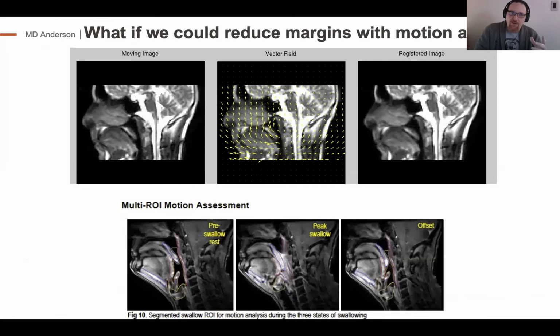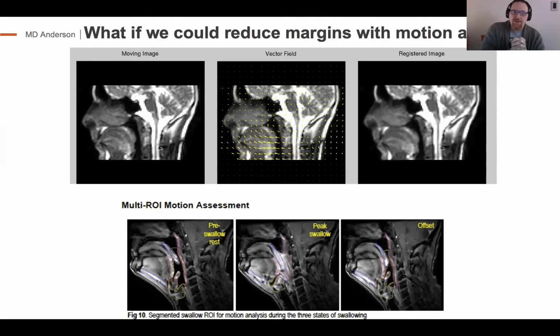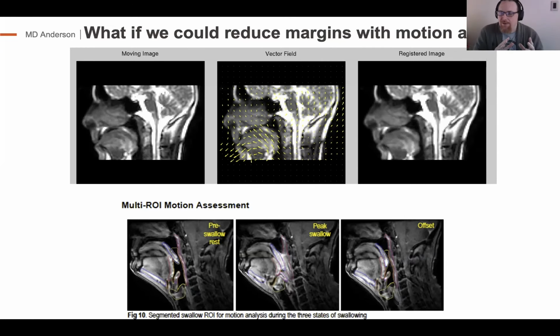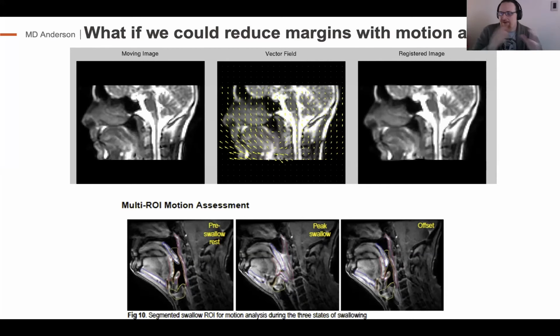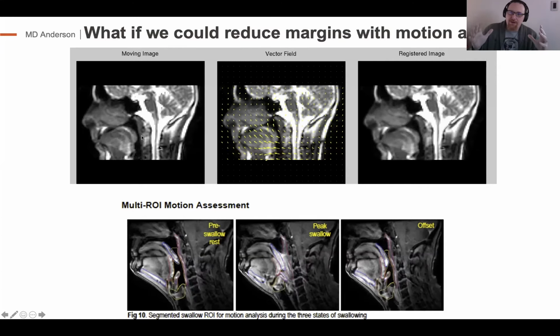So our next question was, well, could we use this to track where things were happening in time? So building on some great data from UMC Utrecht, we partnered with them to look and see if we could look at these swallowing muscles and evaluate how much they were moving during treatment so that we could give a more accurate treatment through PTV reduction. Because when patients are swallowing, these structures really move a lot. And so you can see from this diagram, if I'm targeting this base of tongue area, I'm having to cover a lot of incidental normal tissue just to account for the motion that's occurring during the treatment.